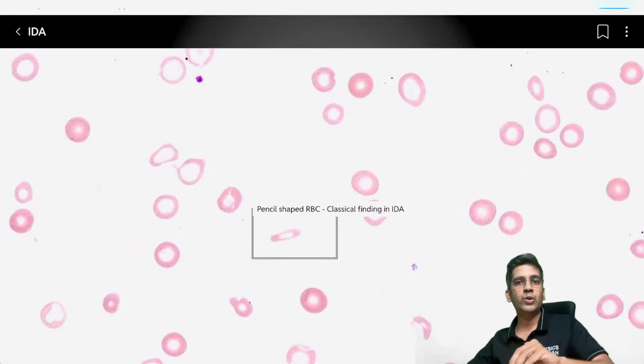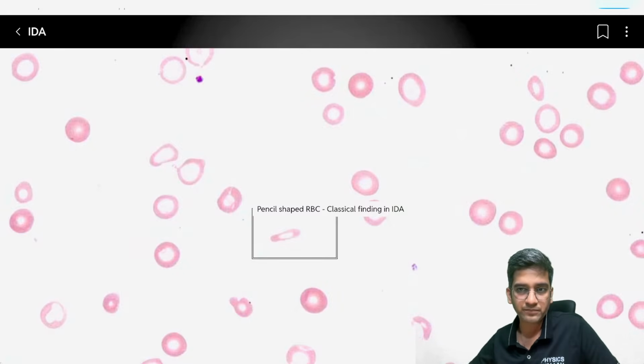Anisopoikilocytosis. Can anyone comment what do you mean by anisocytosis? Fine. Krish, we'll meet soon. This is for your seniors, second year exam going. We'll meet soon for sure.